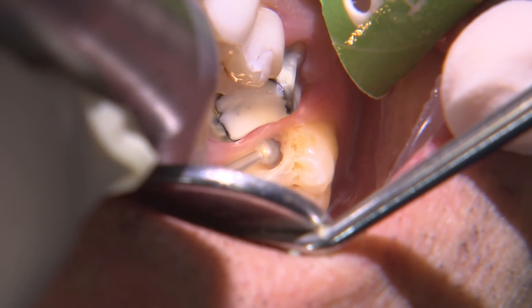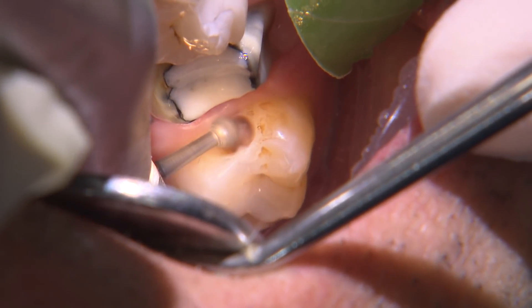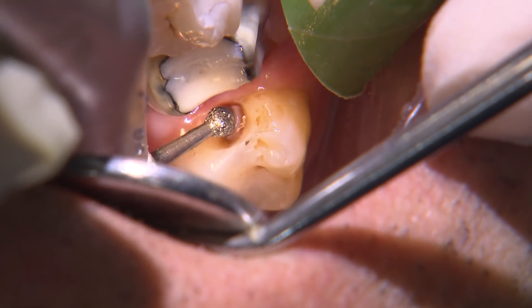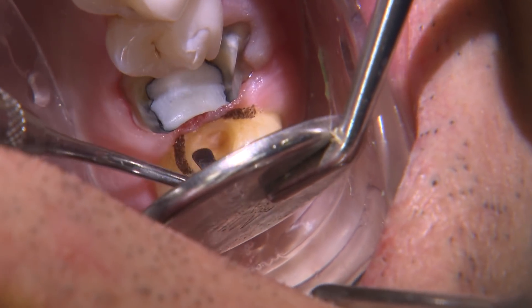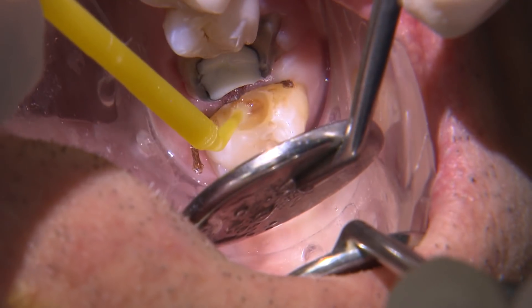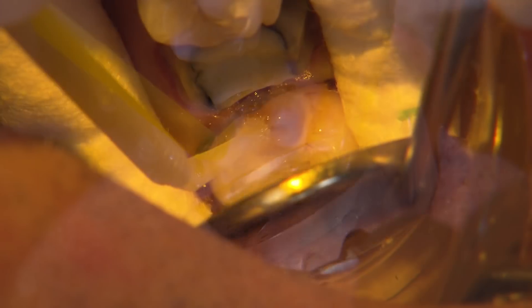Using a round diamond, I begin the caries removal by extending towards the gingival, occlusal, buccal, and lingual until healthy sound tooth structure surrounds the decay. I'll then use a slow speed carbide to remove the deep caries. I place a dry double zero cord in the mesial sulcus to help displace the tissue a bit more apically. I etch the prep with Kerr's phosphoric acid for 15 seconds, rinse and dry, ensuring not to desiccate the dentin.